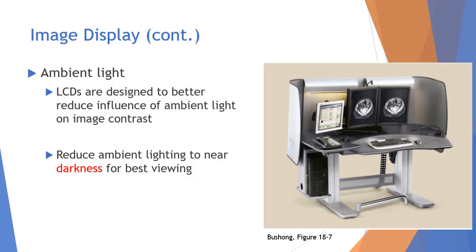Ambient light. LCDs are designed to better reduce the influence of ambient light on image contrast. So reduce ambient lighting to near darkness for best viewing.